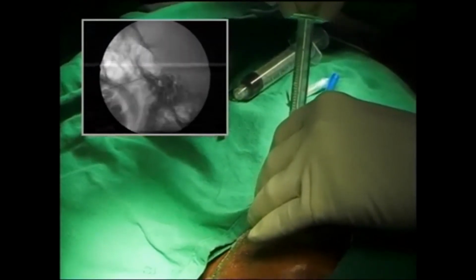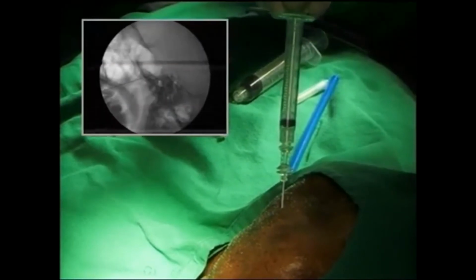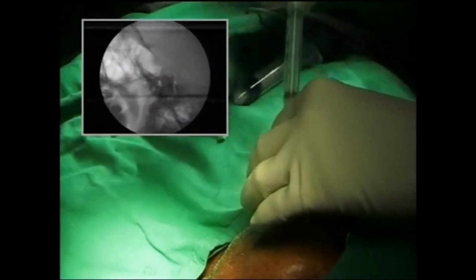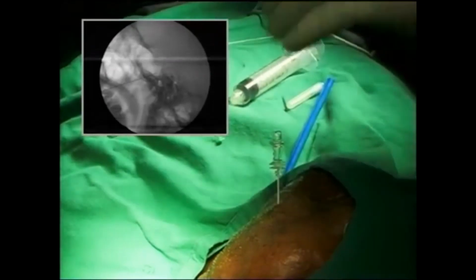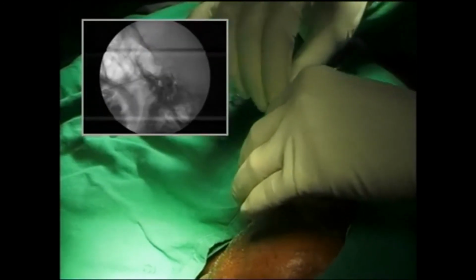So I'm aspirating with the 2cc syringe. You can see here, nothing coming out. Okay? So we'll do the stimulation again and then do the RF lesion and then hopefully sedate him also some more. Motor?